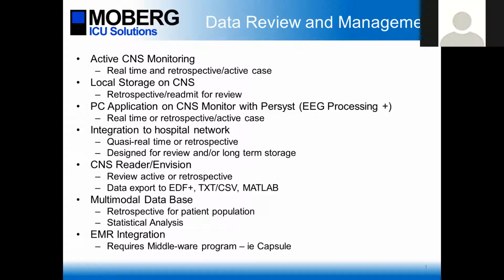Or the entire case can just get dumped onto the network at the end of the case when the patient is discharged. If they're doing EEG monitoring, it's probably best that it gets sent there incrementally, because then that data is available for your EEG folks to look at. So they can access that shared drive and look at the EEG pretty much real time or even retrospectively.